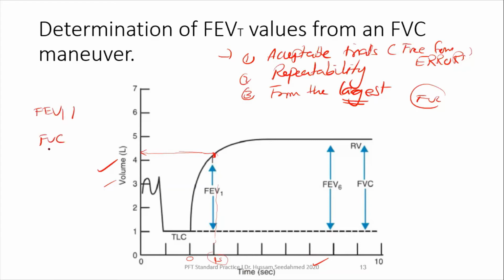For the FVC, you look for the plateau. So this is the plateau. How do I determine the plateau? There should not be an increase. The plateau, we all know what a plateau is.